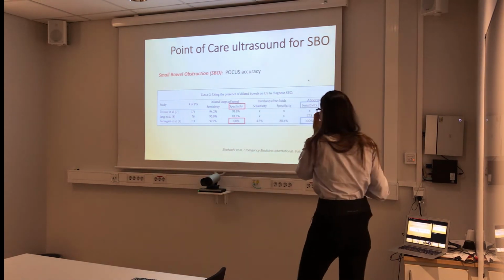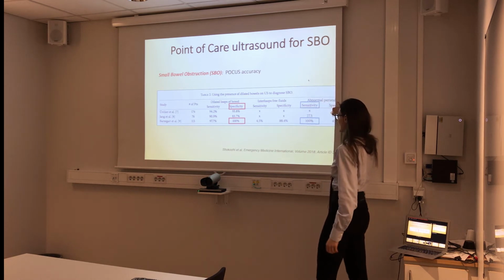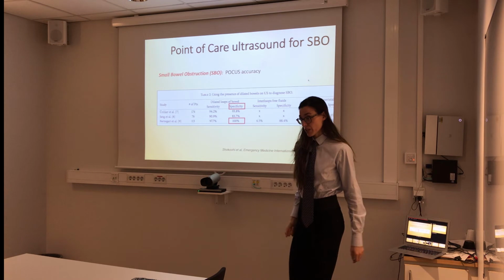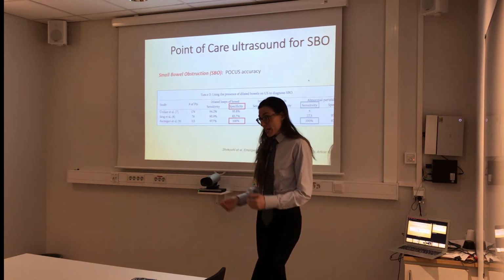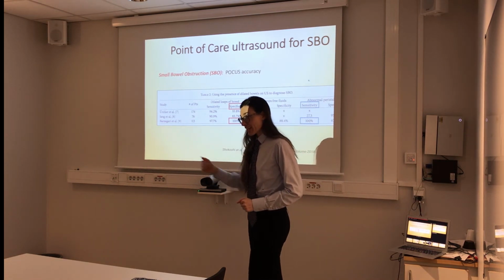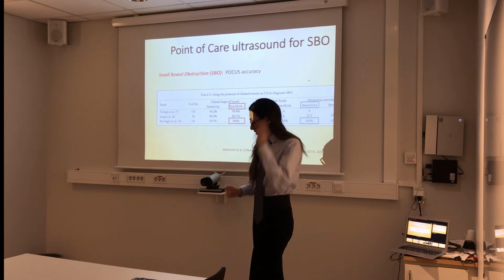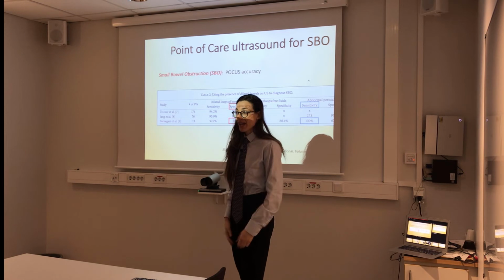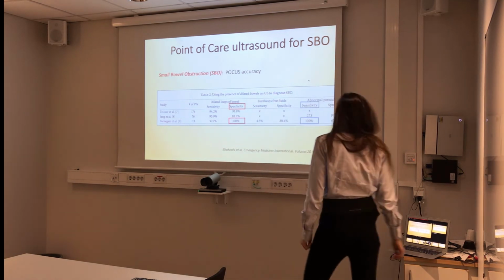Or whatever, okay? Abnormal peristalsis does have a very high sensitivity, but it's not specific, again, because, for example, you can have a mechanical ileus and a paralytic ileus, which is not mechanical, maybe it's not SBO, but it's due to electrolyte disorder, so it's not specific.